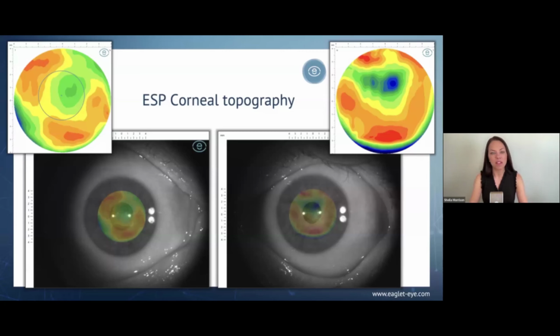Now, a take-home of this section is that profilometry is not only comprehensive ocular shape. Naturally we picture those images with a huge, big eye map that is very appropriate when fitting scleral lenses. But something we sometimes forget, as we're emerging into an era of exploring how we can best fit corneal GPs and OrthoK using profilometry, is that the unit is very successful and accurate in measuring the corneal shape as well as the scleral shape. So what you see is a picture of a cornea, and you can see that central flattening in this patient's case where he had refractive surgery.